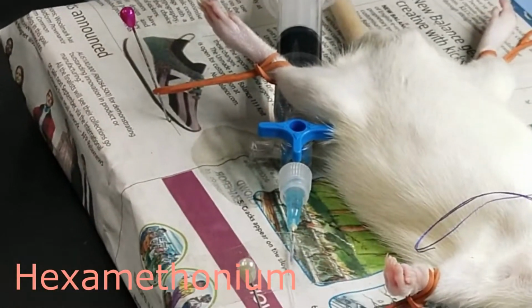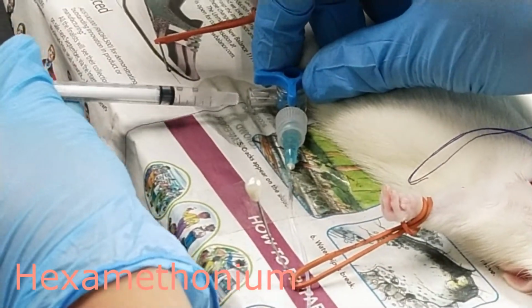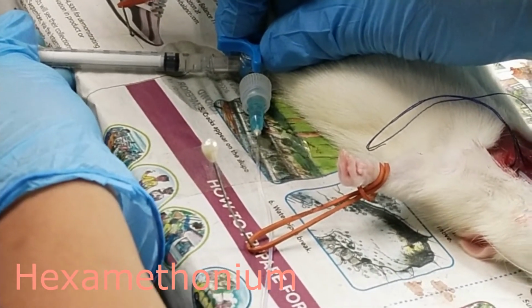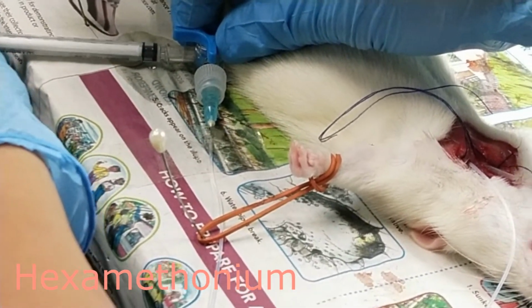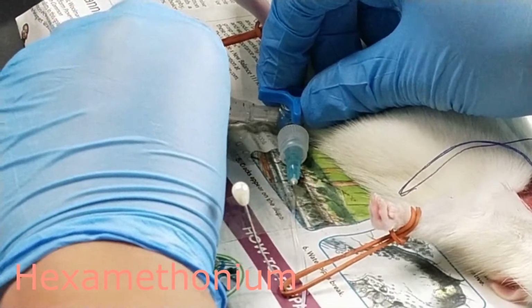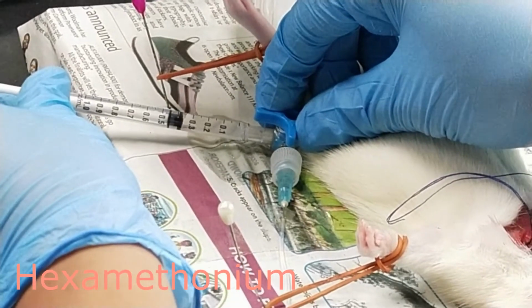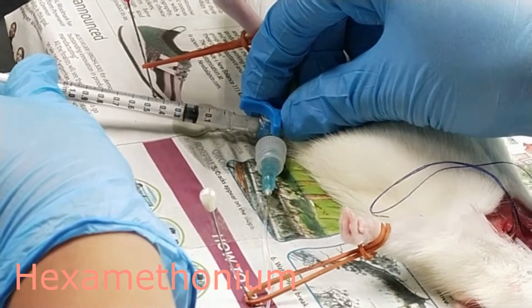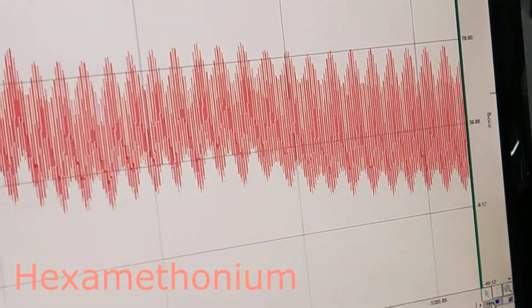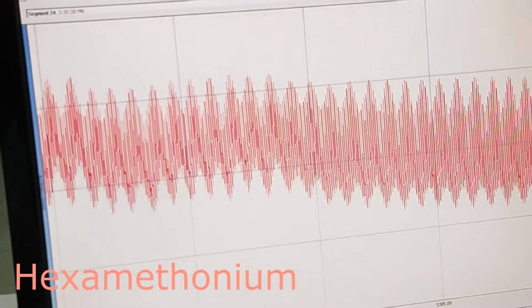And followed by the intravenous injection of hexamethonium. And then we need to flush the system by using 0.5 ml of normal saline. Okay. So after the injection of hexamethonium, you can see that the blood pressure is slightly decreased compared to the normal.